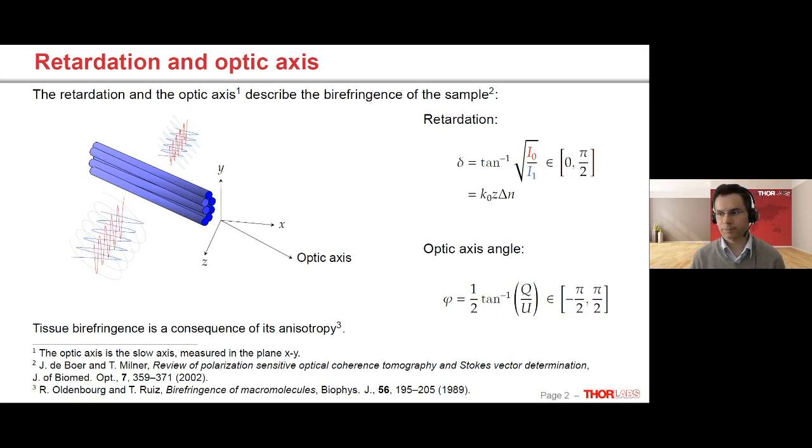Okay. Can the optic axis information be interpreted as the actual local optic axis at the given depth, or is it an accumulated value over the depth? We have the accumulated value over different depths. This is what we provide right now. We also provide the spectral data, so the raw data, so more clever algorithms can work that out. We do not have that yet.